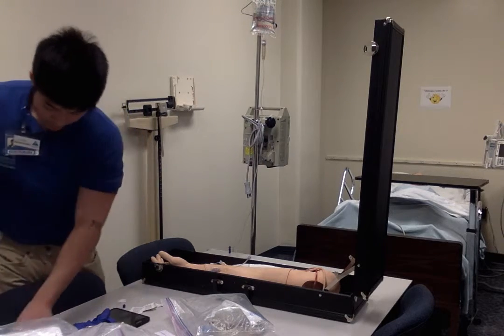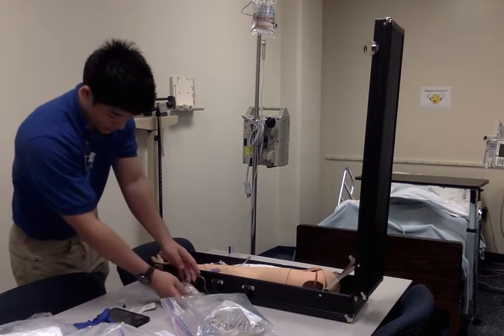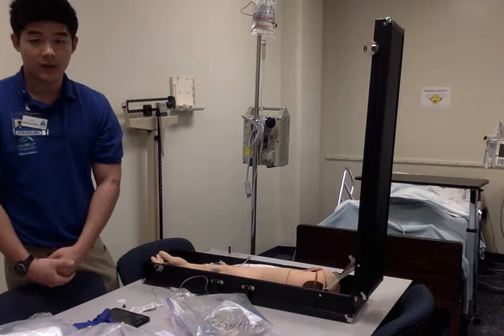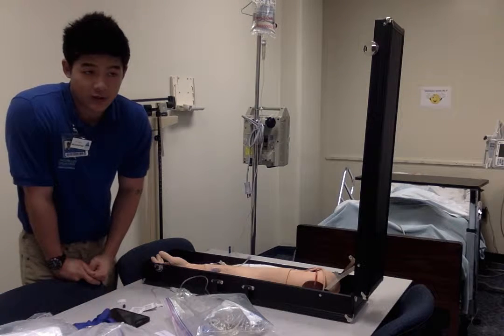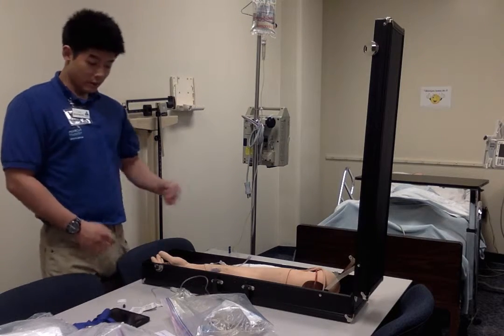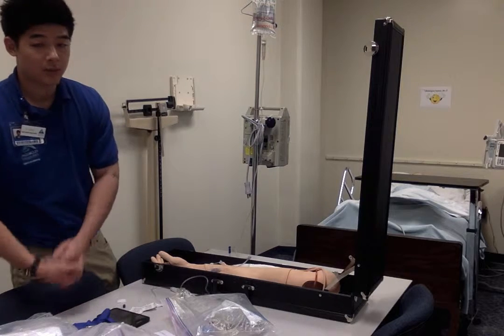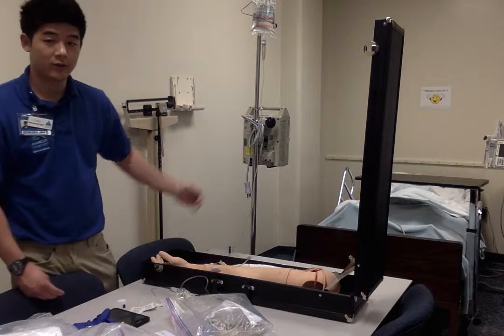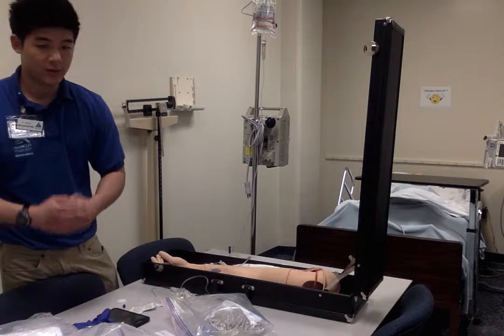So I'm going to take everything to the patient's room and do my hand hygiene. And then I'm going to go inside and introduce myself, do the 2 identifications, which is the birthday and the patient's name. I'm going to explain the procedure, what I'm about to do. I'm going to tell the patient that I'm going to apply the medication through this bag, and tell the patient any side effects of the medication and what the patient should know.